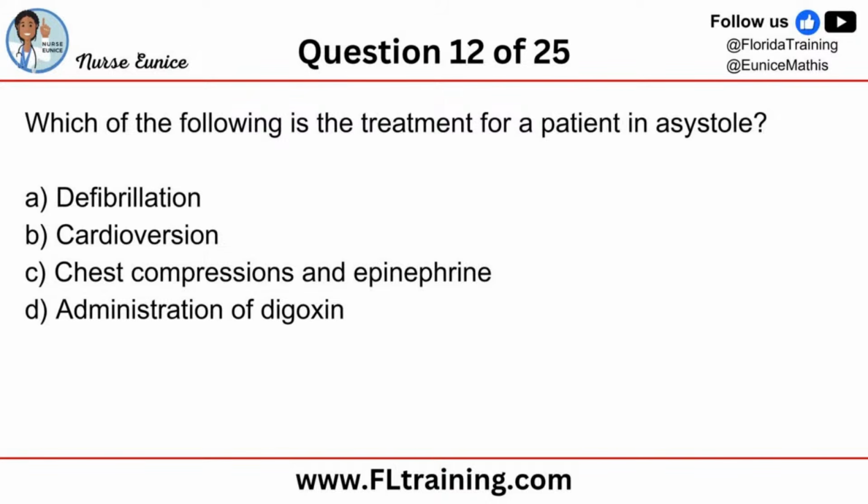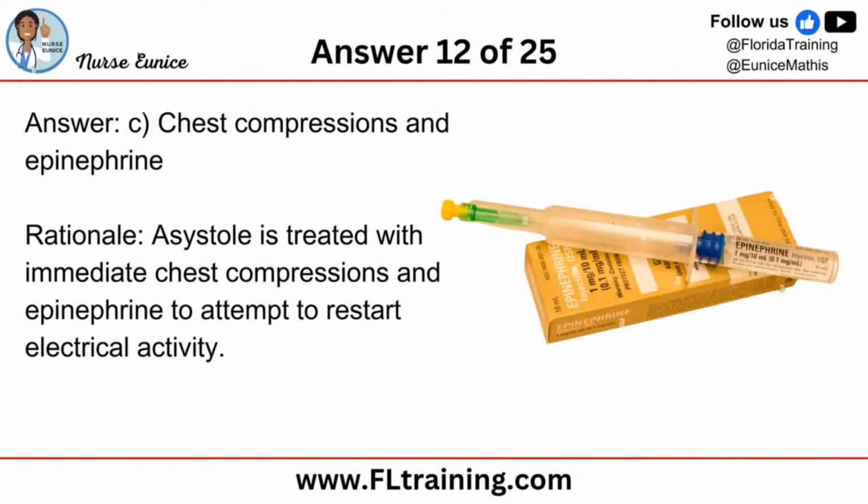I'll give you 10 seconds before I reveal the answer. Remember, asystole, they don't have any energy. So we can't shock something to get something that wasn't there. So you would not defibrillate asystole. I see a lot of correct answers. If you chose C, great job. It is chest compressions and epinephrine.